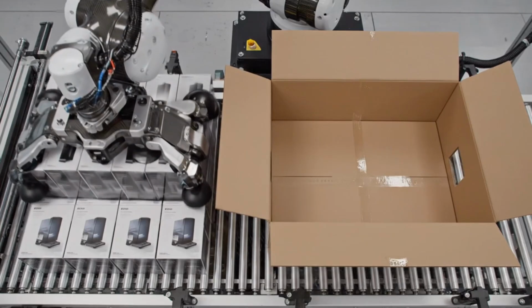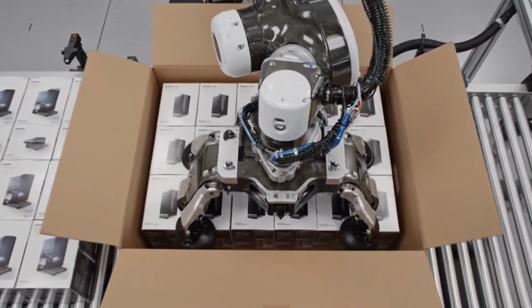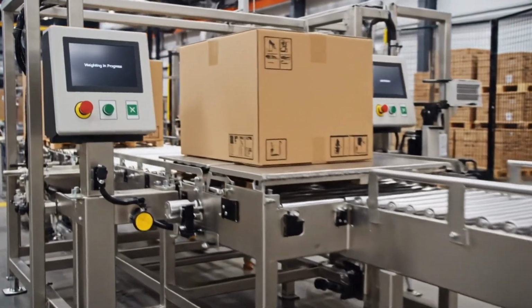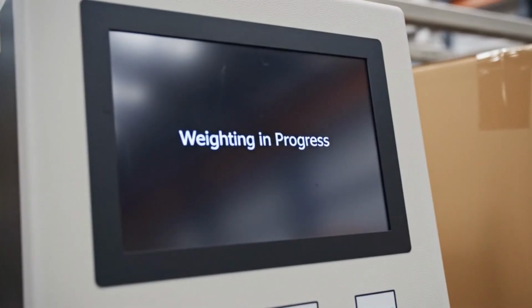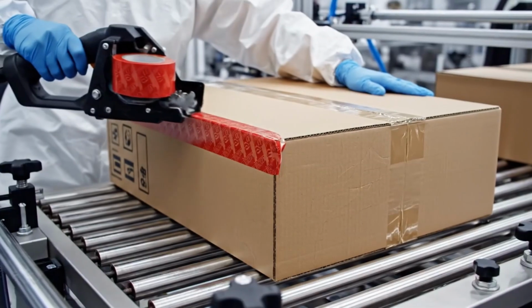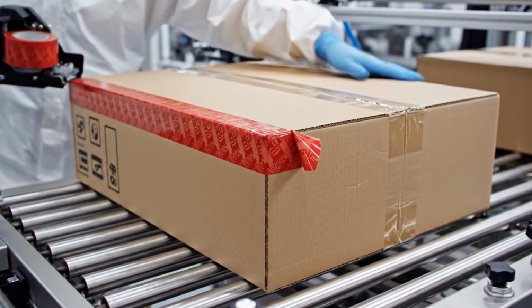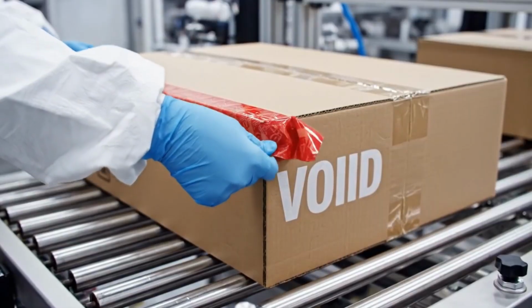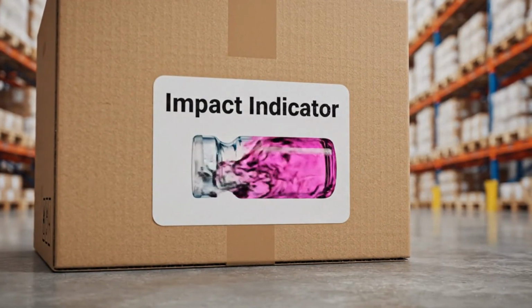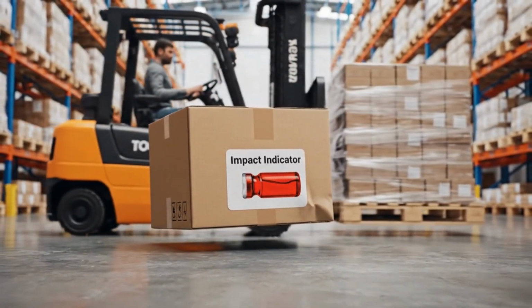Every millimeter of space is calculated. A tight pack is a safe pack. We don't count by hand, we count by gravity. Precision at this scale is the only way to manage global demand. Security is a 360-degree commitment. From the factory to the pharmacy, the seal must remain unbroken. We monitor the journey. These sensors tell us if the product was treated with the respect it deserves.